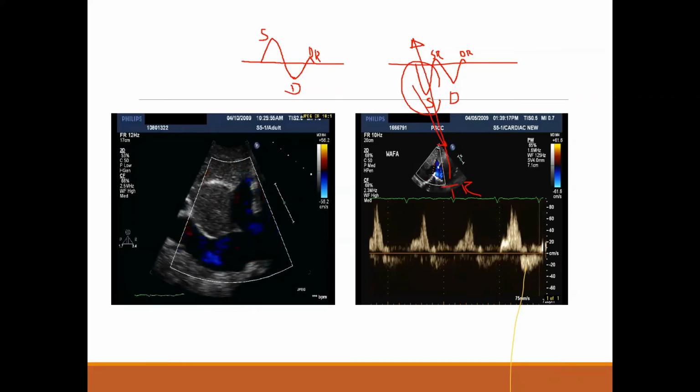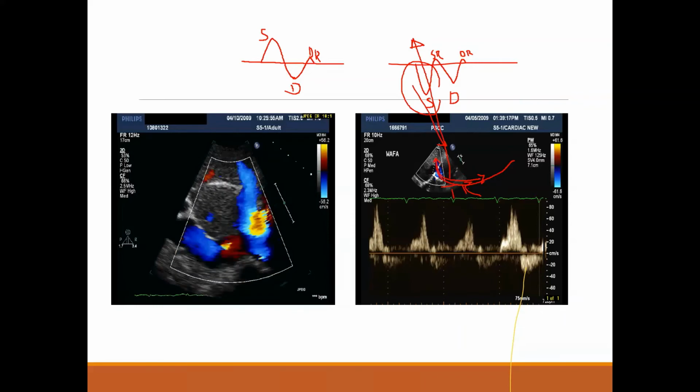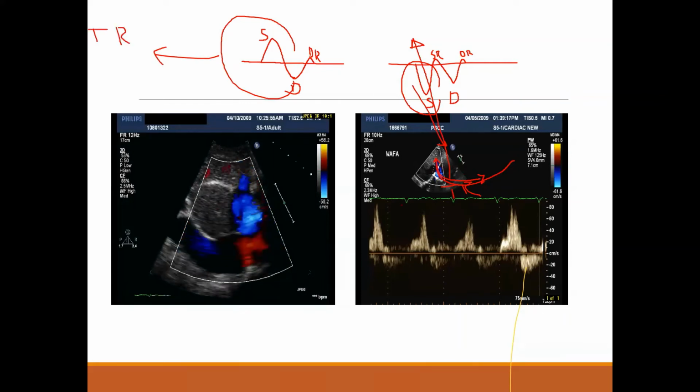Physiologically, the hepatic vein during this time is emptying blood into the right side of the heart. But now, because of the severe TR, exactly the opposite is taking place. So instead of seeing the forward flow below the baseline, I'm seeing it above the baseline, because now it's coming back instead of going forward. So whenever you find this one, this indicates severe TR confidently.